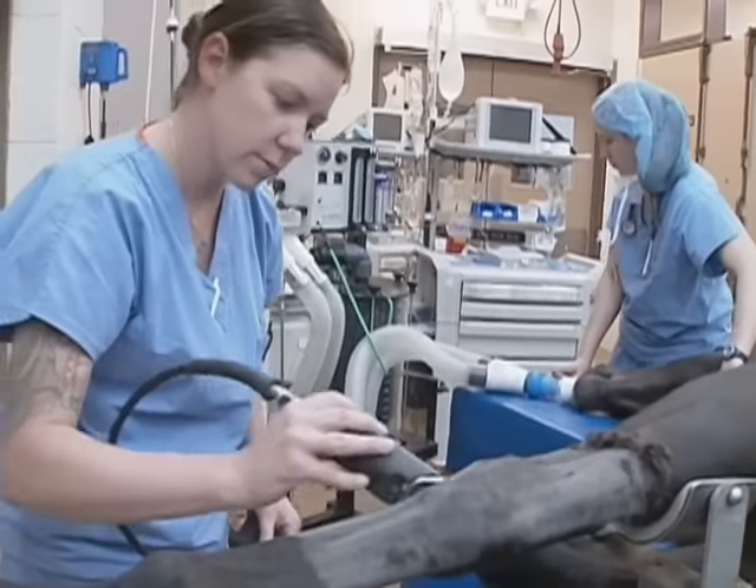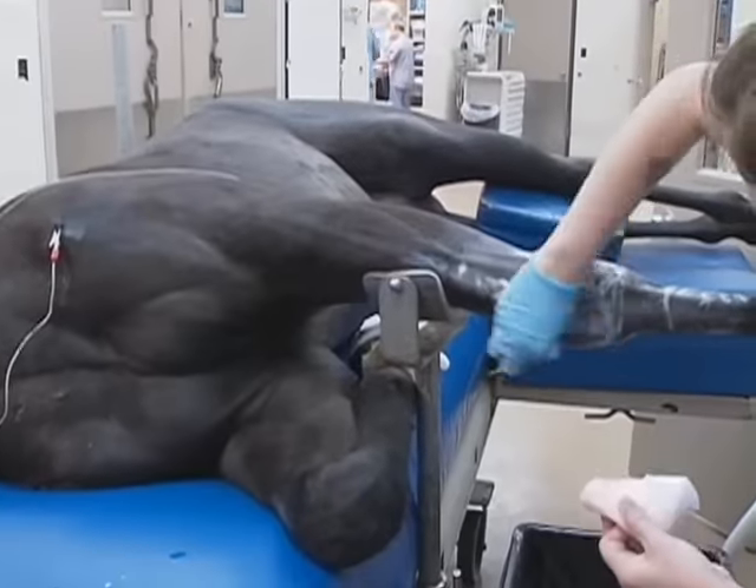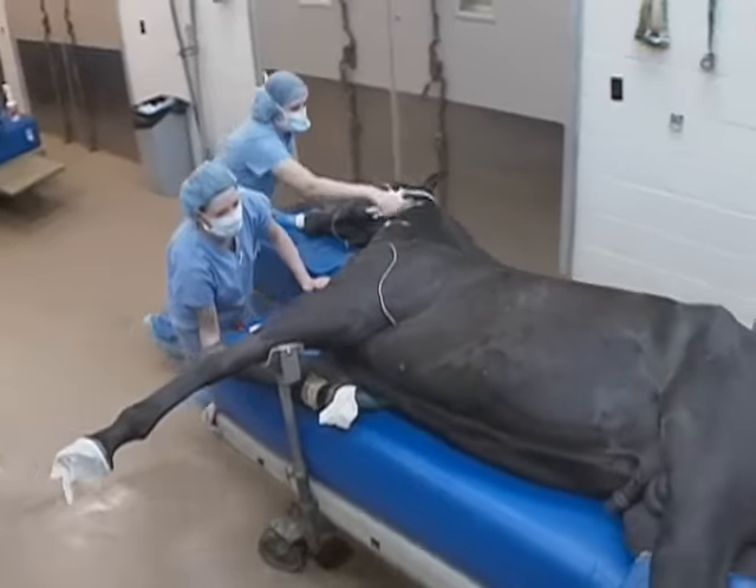In order to prepare the leg for surgery, we clip the hair, we shave the area for the incisions, and then we prepare the skin with antiseptics. After preparation of the leg, the horse is ready for surgery.